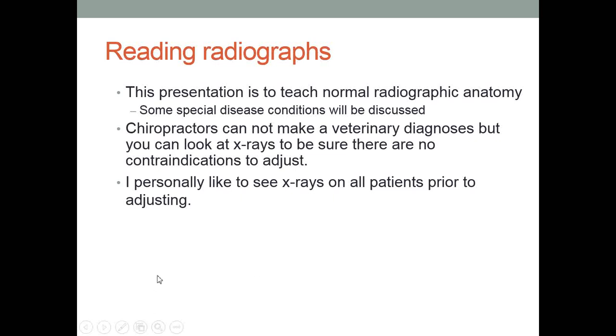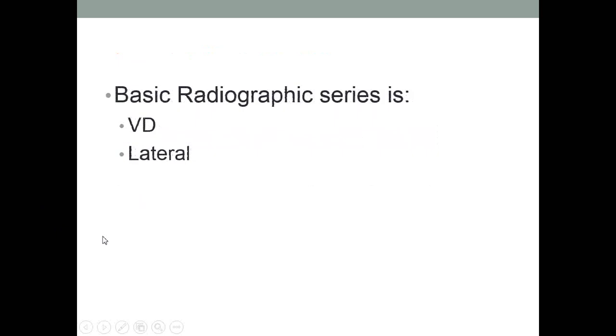Veterinarians, on radiographs, radiographs are always necessary to find solutions. I think you can see subluxation sometimes on radiographs, but sometimes you can't. So I want to see those more for contraindications and to try to help the patient understand what's going on with the animal. So hopefully it's clear, and hopefully not too verbose as we get into this.